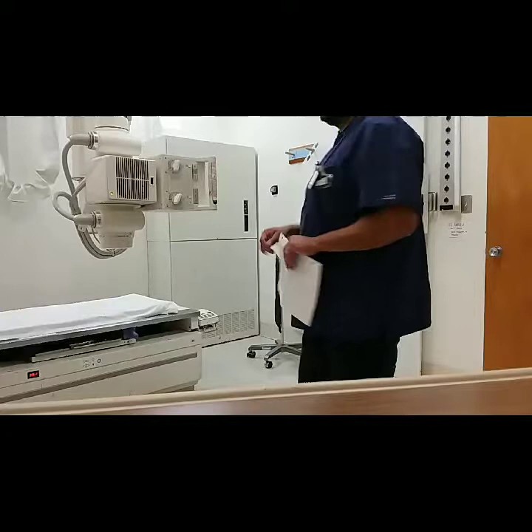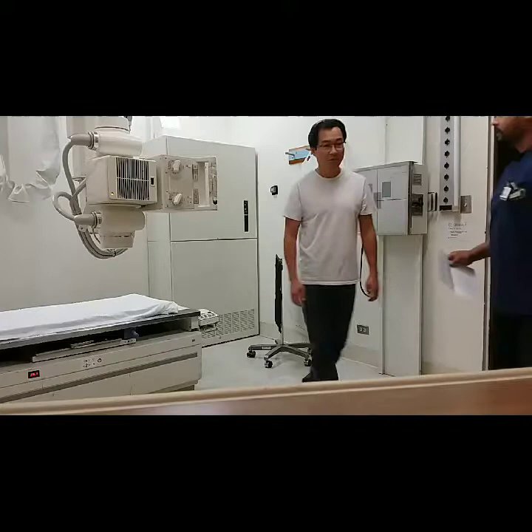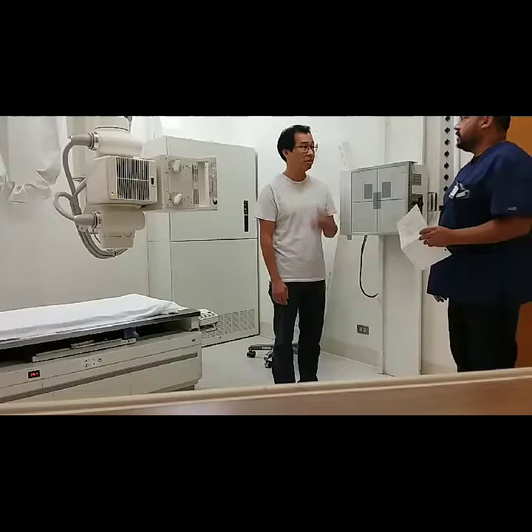I am going to go get our patient. Today we are going to do a couple of chest x-rays. What brings you in today? The patient states he has shortness of breath.